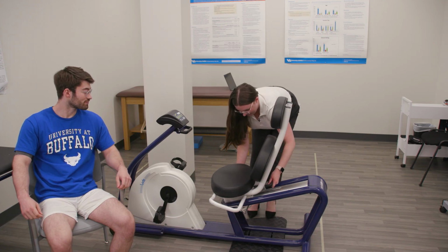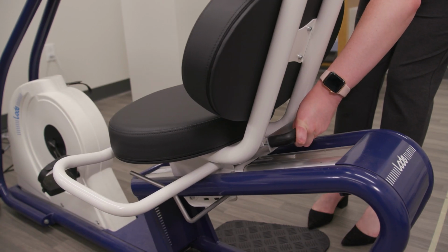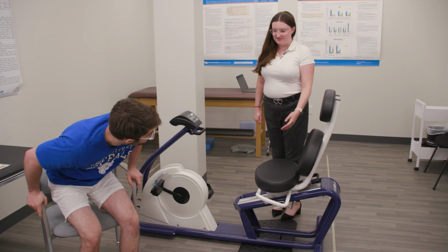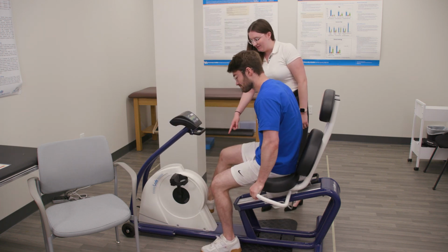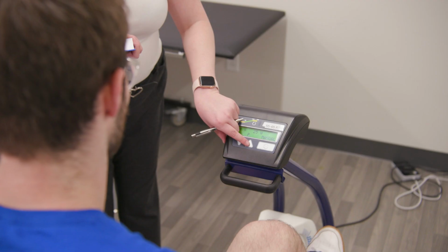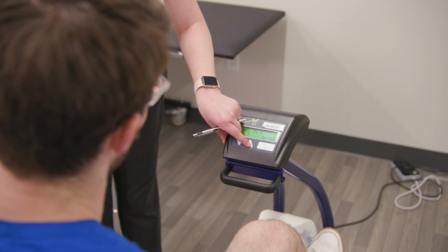Before the patient sits on the cycle ergometer, adjust the settings, seat, and handlebar heights as needed. The bike should be set to the correct power output based on the examiner's prior calculation. Record stage 0 values right as the patient begins to pedal. Stage 0 occurs when the patient sits on the cycle ergometer immediately after starting the BCBT.